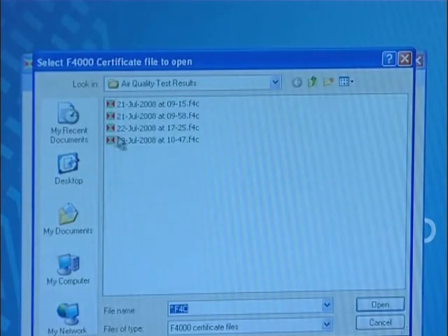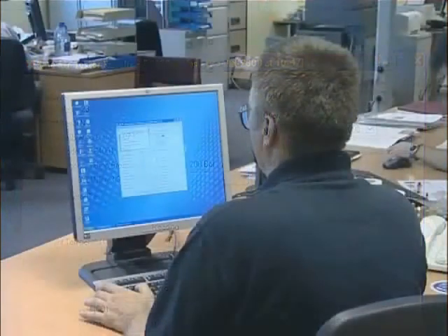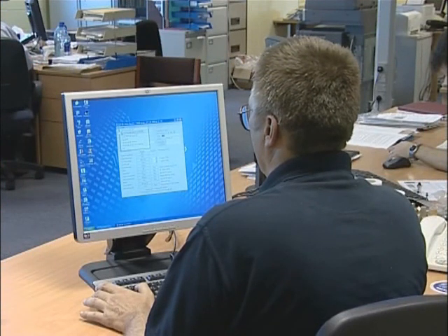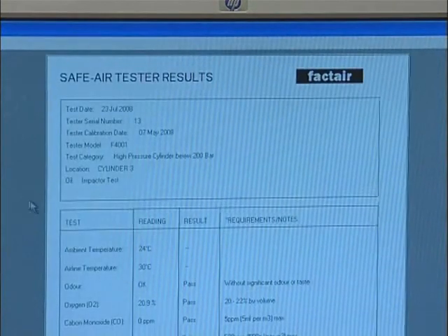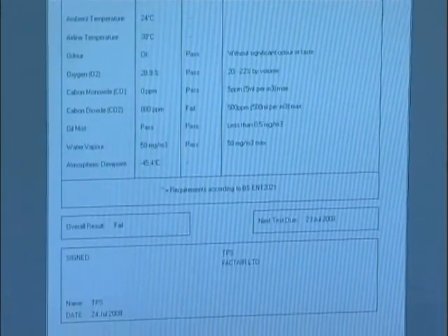Individual test records can then be opened from the File drop-down menu by selecting Open a Test Results File. Once loaded, further information can be added about the test location, engineer, and their address. The engineer and address details can also be saved as a default. When complete, you can save the test result file and, if required, print off a certificate. In the UK, Health and Safety Executive Guideline HSG 53 recommends test results should be retained for a minimum of five years.